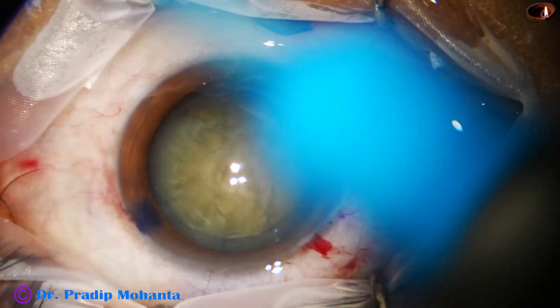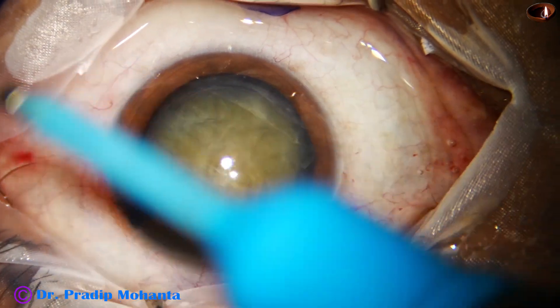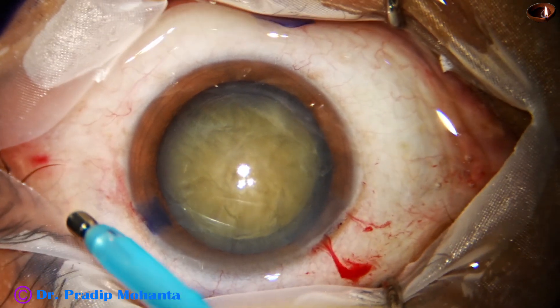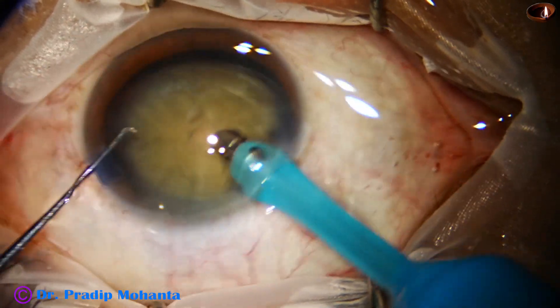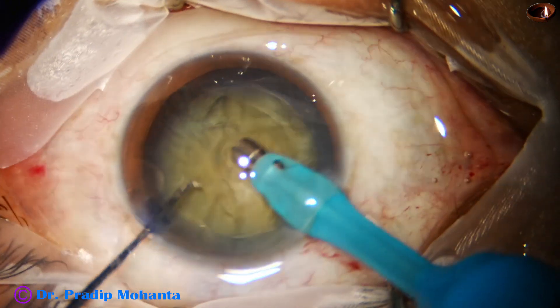And now we are going to manage this nucleus. It's quite a hard nucleus — nucleus sclerosis grade 4. Now is the time to introduce the phaco needle. The tip of the phaco needle goes in, and some superficial cortical lens matter is removed.